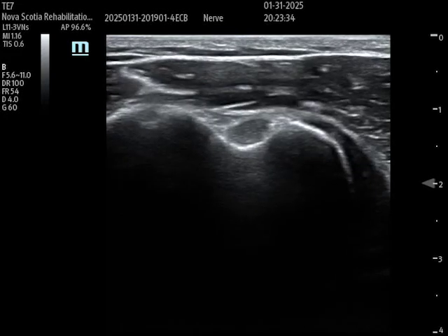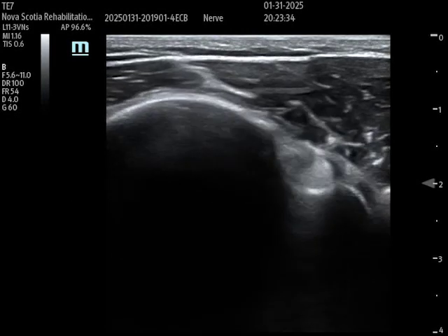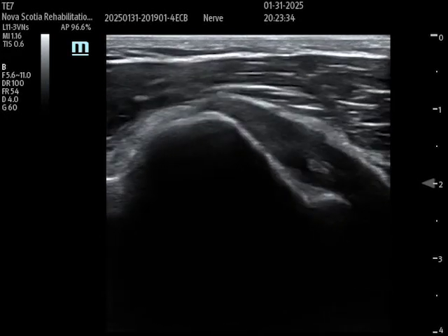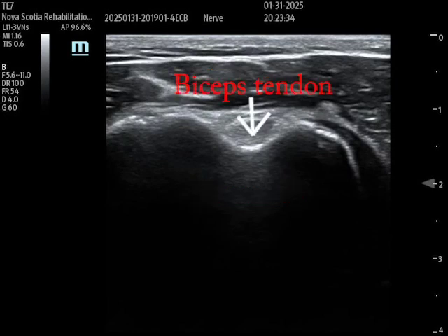Here I've identified the biceps tendon. External and internal rotation of the shoulder can change the location of the groove, which is why it's best to start with the shoulder in neutral rotation. Here I'm doing internal and external rotation, and you can see that the location changes. In the pre-scan, you can identify the overlying deltoid, the underlying humerus, the nice bicipital groove in neutral rotation, and the biceps tendon running directly in that groove.